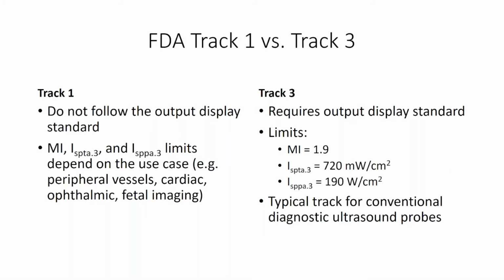And these devices have to have a manufacturer supplied manual. It'll have to clearly dictate where this is to be used, and the manufacturer will ensure that for that use case, the MI, ISPTA, and ISPPA do not exceed the limits provided.